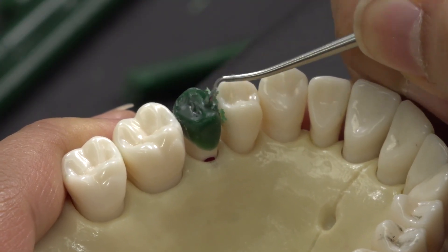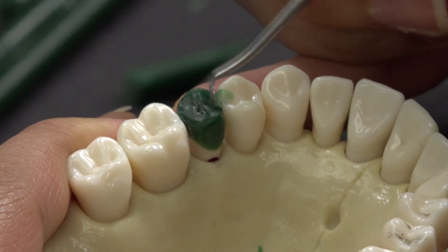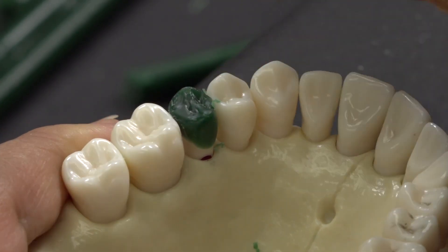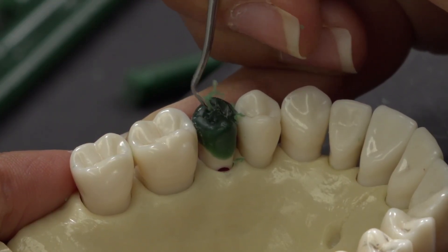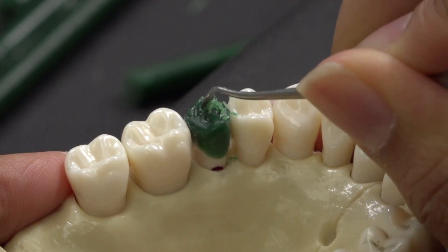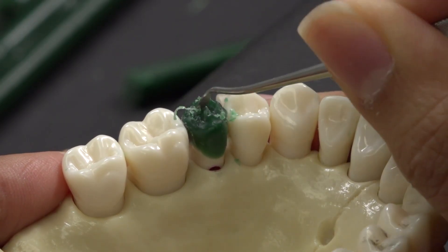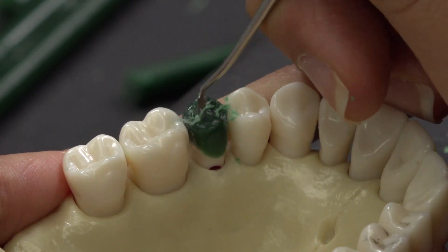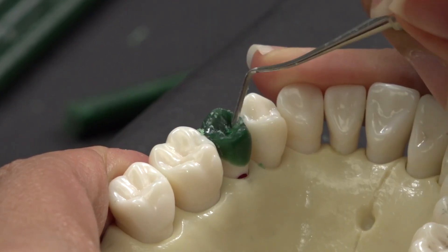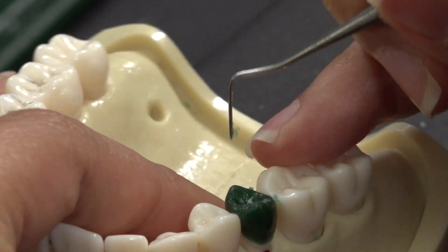I use carver number 3, the spade side, to draw in the two triangles. The point of the spade side will create the fossa.